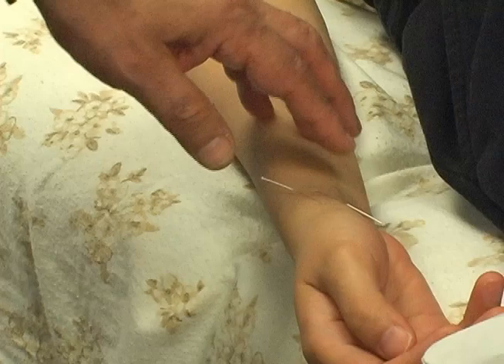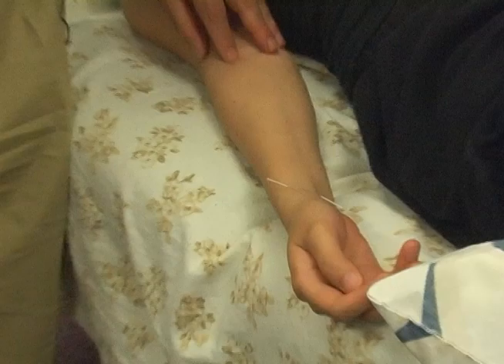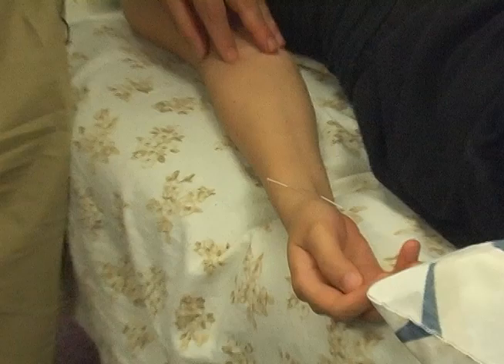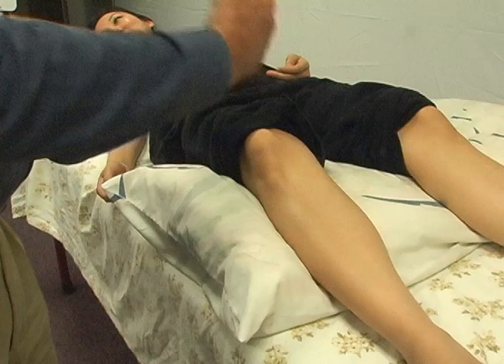As you get closer to the elbow, we use deeper points and go in deeper. For example, for spleen 9 I would use a 40 millimeter needle and go in deeper. If she was having menstrual cramps, I would check spleen 9 or spleen 8 — which is from TCM — as my branch treatment and treat that. However, my treatment's not over once I correct the root treatment; I want to find out if there are still any excesses or deficiencies.